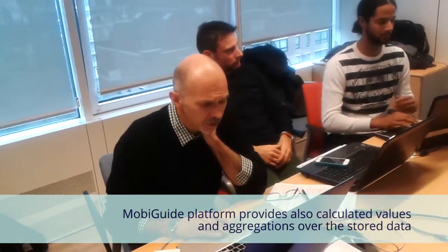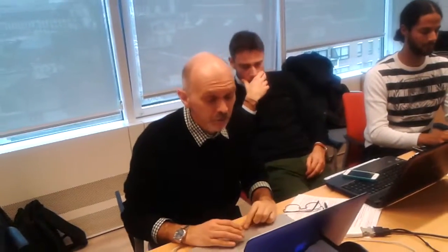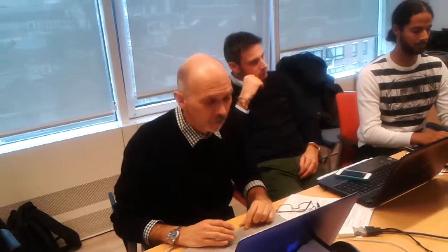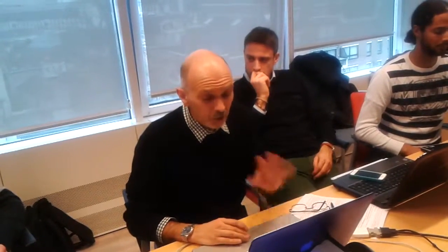And we have the standard deviation of the RR interval that gives us an idea of how much the heart rate changes, and therefore again we may decide different therapeutic approaches depending on the type of atrial fibrillation that we can detect from here. So basically what we see in this simulation is that the patient has a switch from paroxysmal atrial fibrillation to permanent atrial fibrillation.